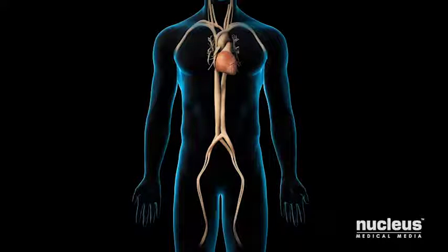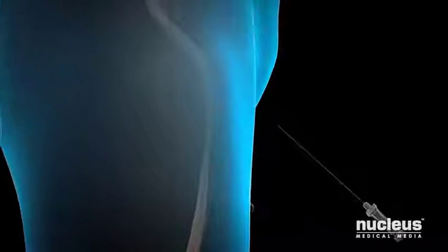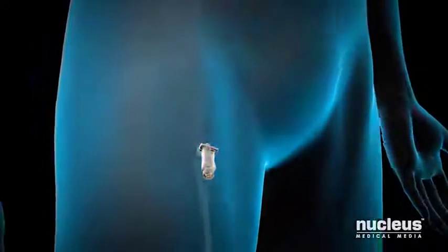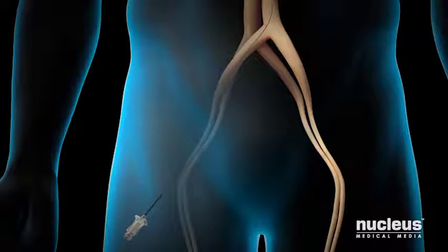Depending on whether the angioplasty is done through an arm or leg artery, the doctor will numb the skin in your groin or wrist area. Then a needle will be inserted through your skin and into your artery. Once the needle is placed, a flexible guide wire will be passed through the needle into your artery. The needle will be withdrawn and exchanged for a small flexible tube called a sheath, permitting access to your artery. You may feel pressure when the doctor inserts the sheath through the skin into your body, but you will not feel the movement inside your artery.